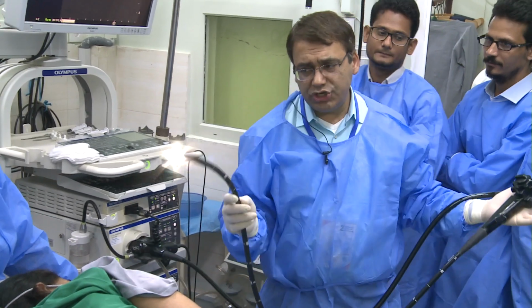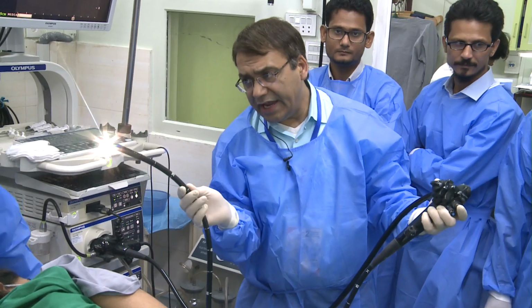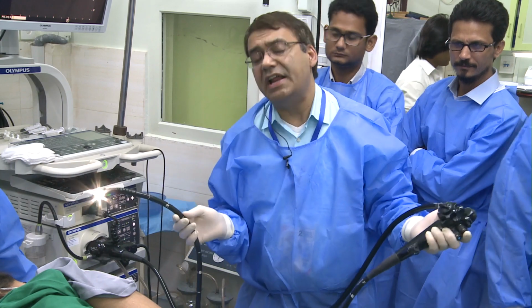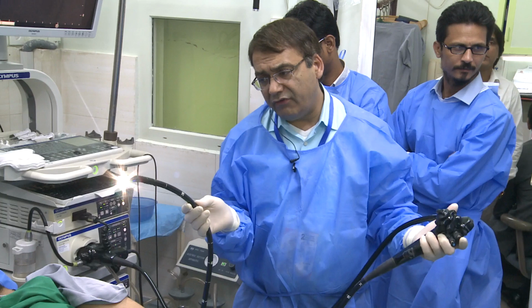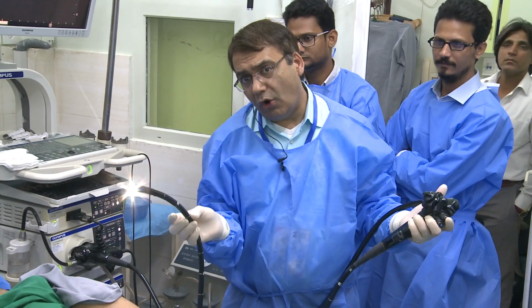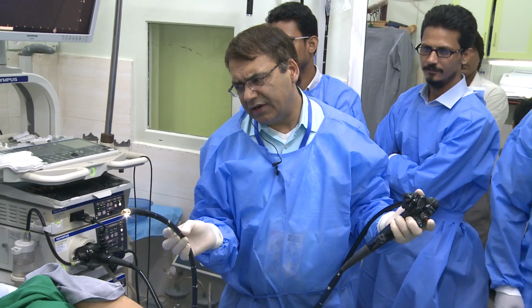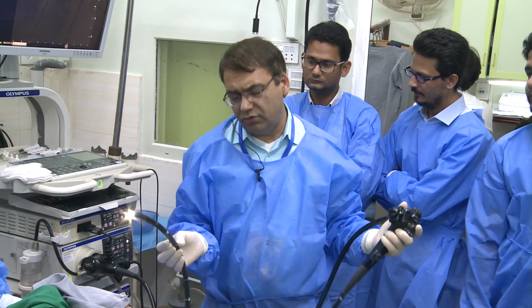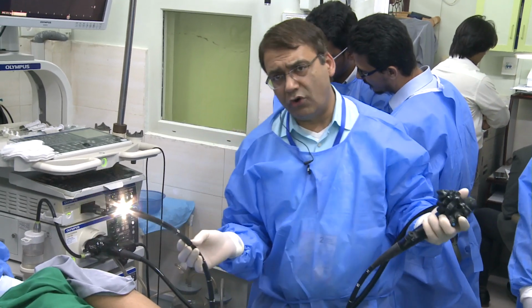So the way I intubate the patient is, most people just go in and bend it like this and then go like this. That's not how I do it. Again, there's nothing wrong with that. My favorite way to do is just like we do an oral airway. And the other day, Dr. Saad was telling me that you even do an EGD scope that way too. I didn't realize I was doing that with the EGD scope as well.